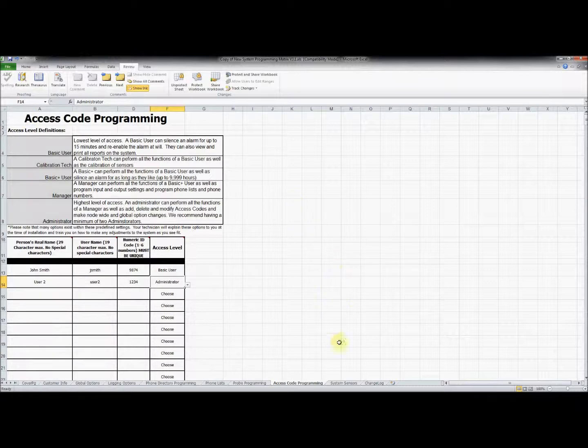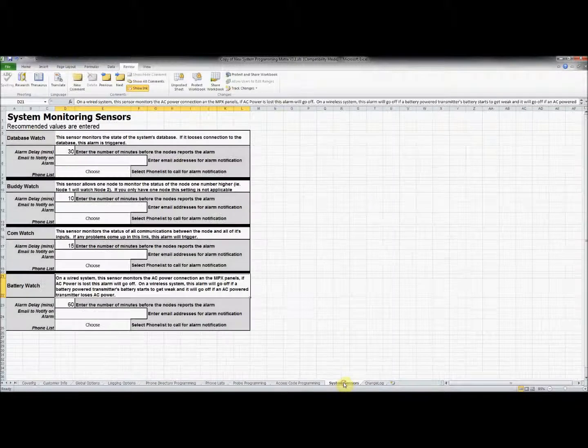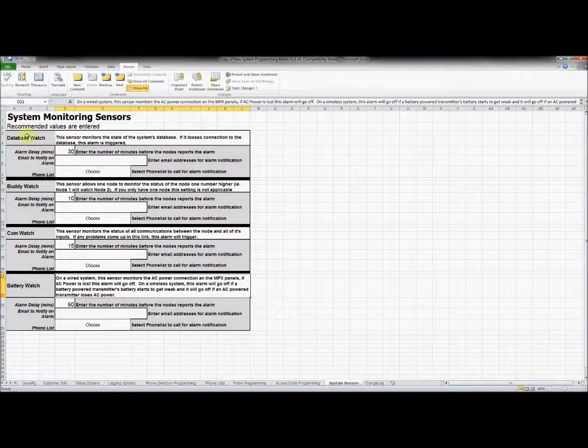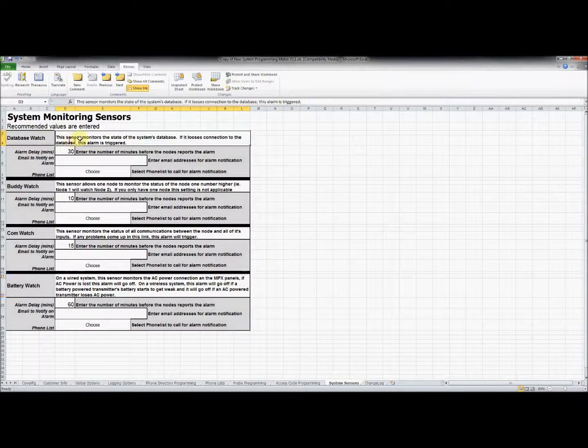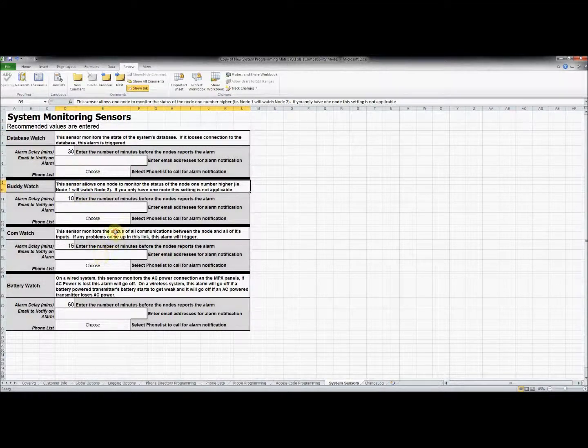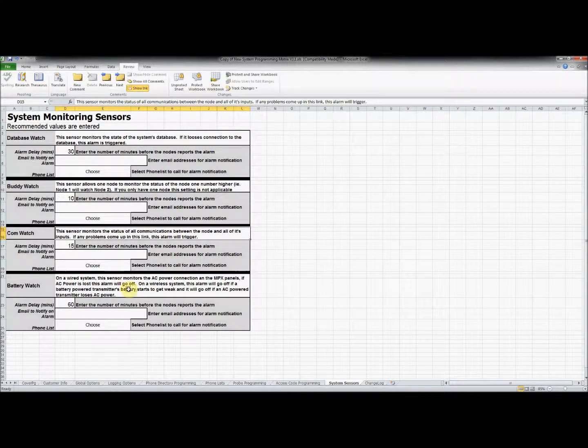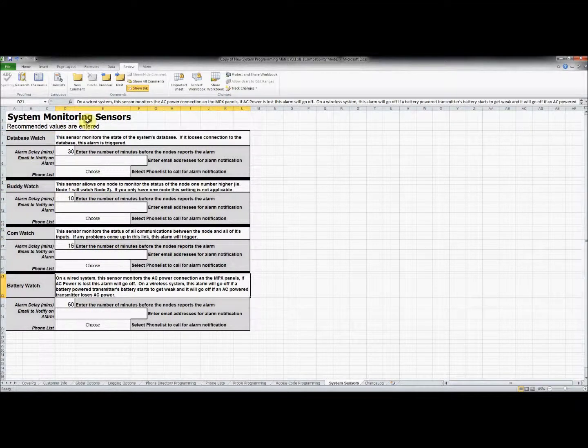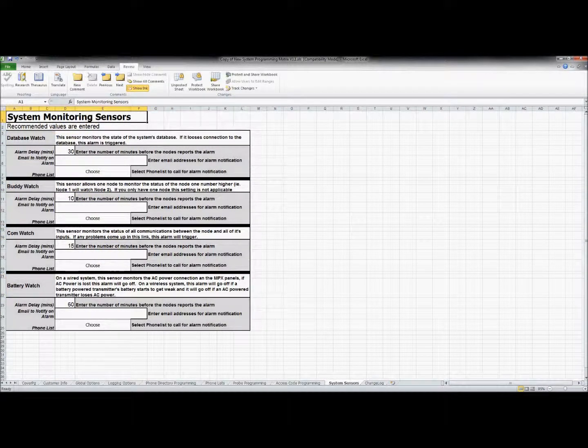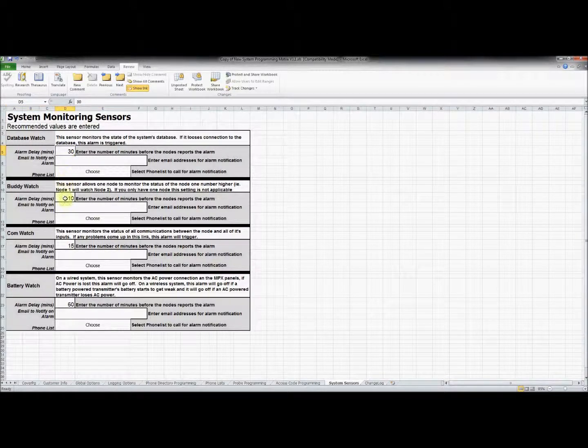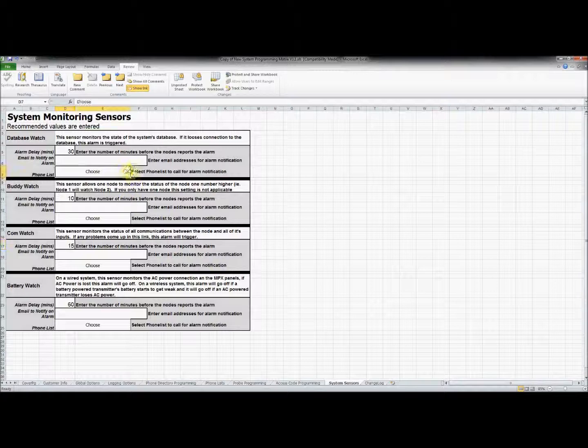In the next tab we will set up the options for the system monitoring sensors. For each of these sensors you will find a brief description of the function and options for an alarm delay, email function, and phone list. Recommended alarm delay values are already entered but you can enter the information that best suits your needs.